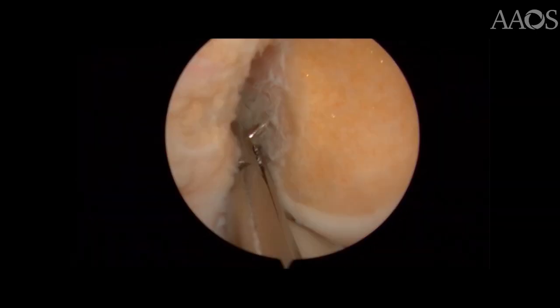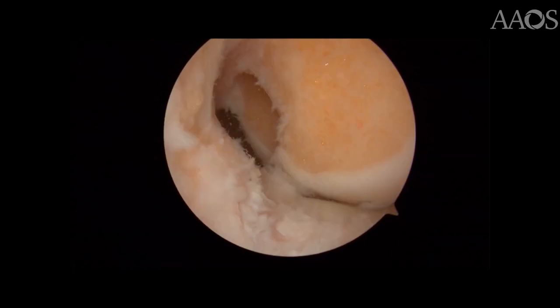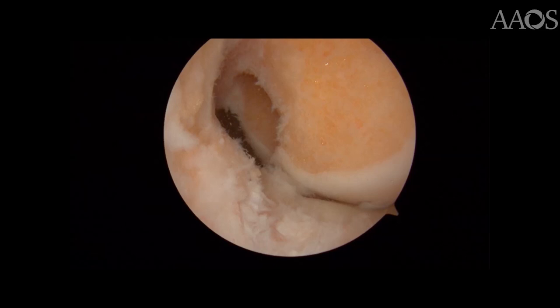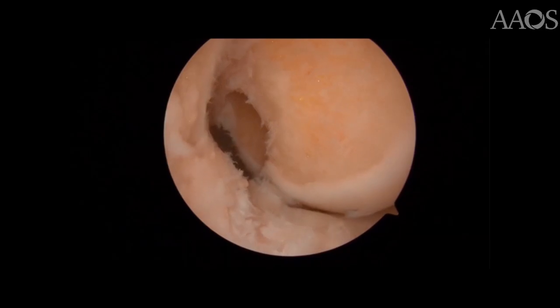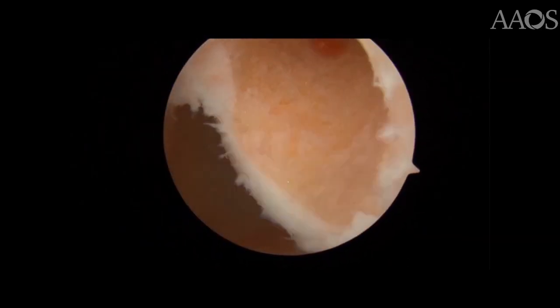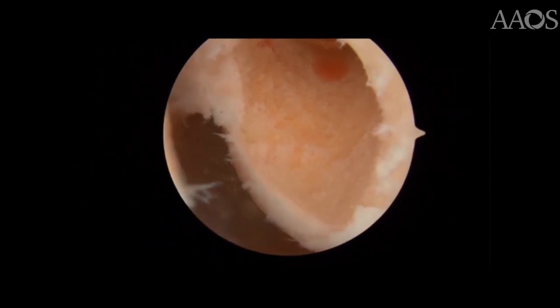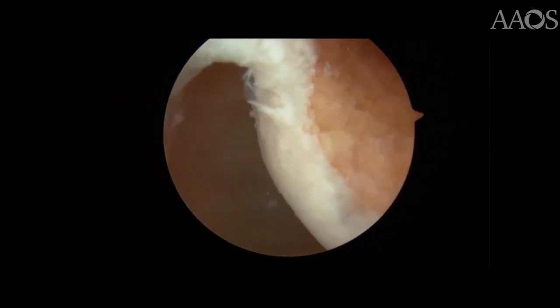A pituitary device can be used to hold the guide pin in place during outside-in femoral tunnel drilling. An accurate perspective of the femoral tunnel created is seen here, with an adequate back wall clearly visualized. A 360-degree view shows the anatomic femoral tunnel created using an outside-in technique, with an adequate 2 mm of back wall clearly seen.